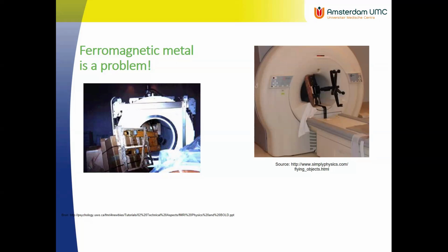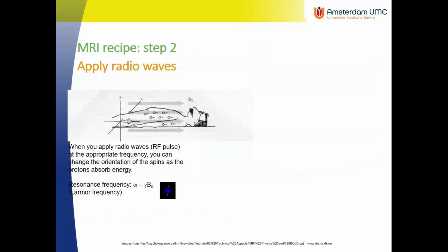Apparently, if you take the right safety precautions and work with it in a safe way, the hazard is rather limited, and only a few accidents have actually been reported in hospitals with MRI scanners. So it is a useful machine that can be operated safely. That's my conclusion. Anyway, step 2: we apply the radio waves for the excitation pulse.